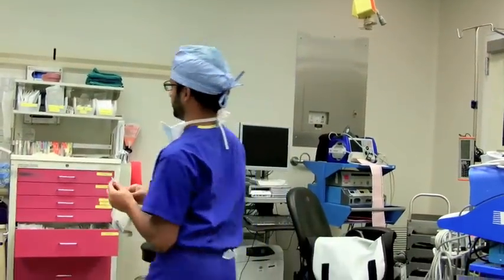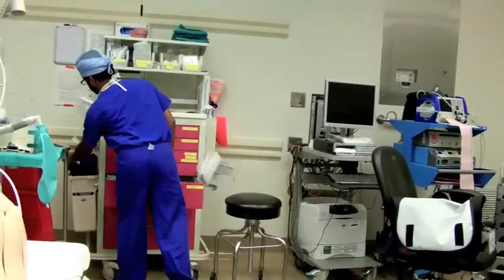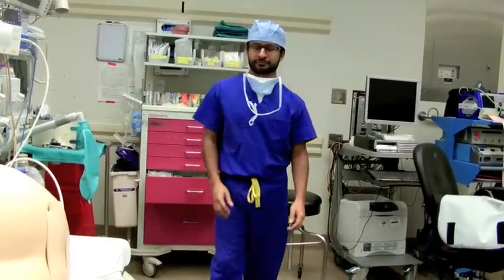After laying your patient on his side and vitals being stable, make sure to throw away all your sharps into a sharps container. That's the conclusion of the teaching module checklist for performing spinal anesthesia.